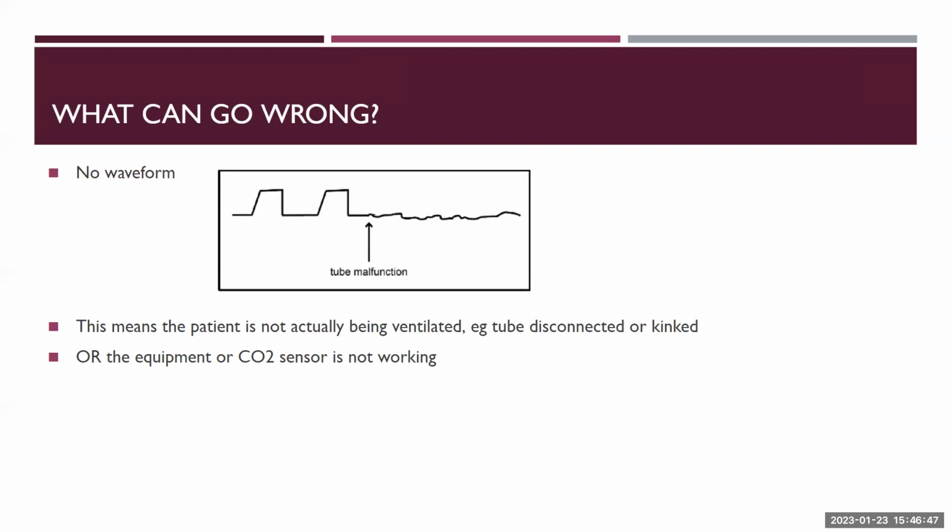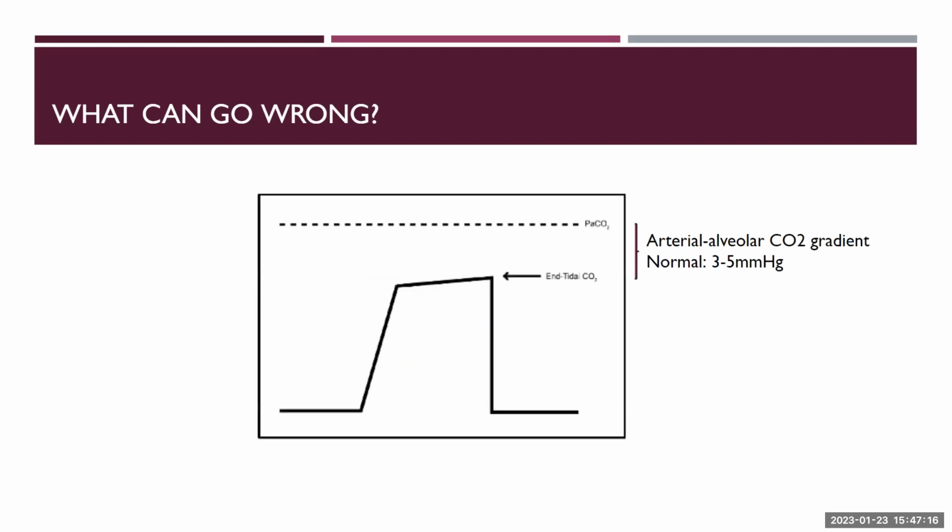So always a benefit to really check the machine and make sure there's no issue with the machine before you really start making big changes in patient care, because it could be a really quick fix of like there's just not a correct CO2 monitor on that machine and the patient's actually fine. And that's a much quicker change than trying to kind of work through the pathophys of the patient and you didn't even think about the machine malfunctioning. So different ways that it can go on.